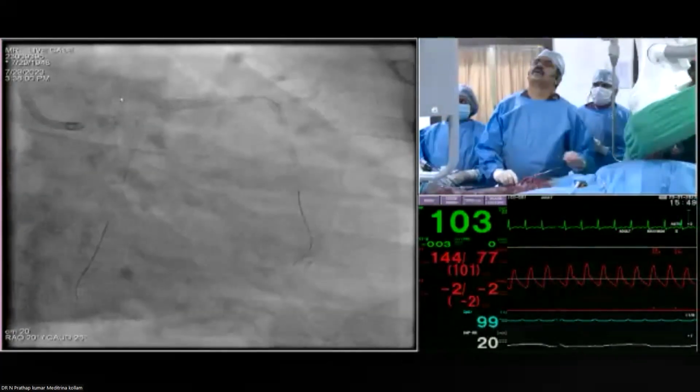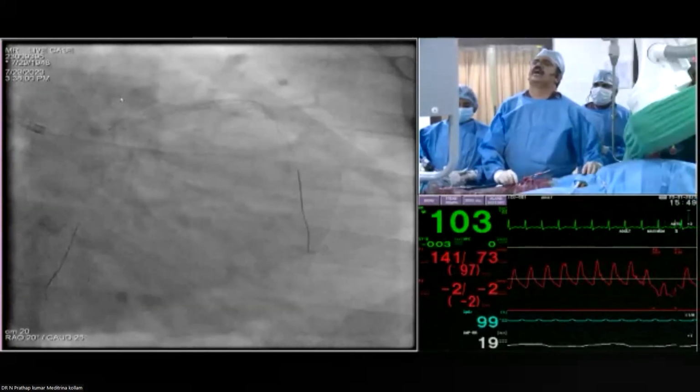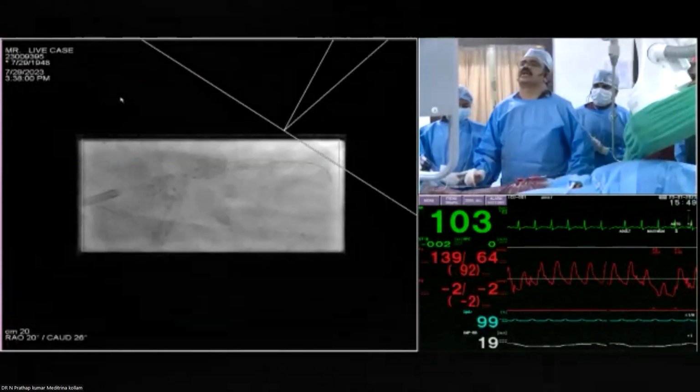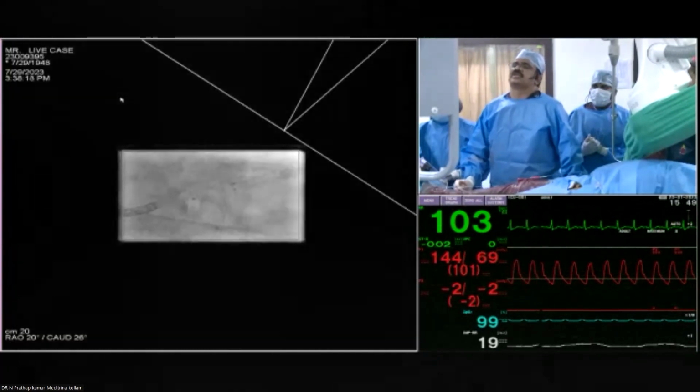Yeah. Stent placement, you can see the stent. Can you just look at this? This is a clear stent. Can you show the clear stent? Because the balloon is actually there. Clear stent can demonstrate whether we have covered the ostium or not.